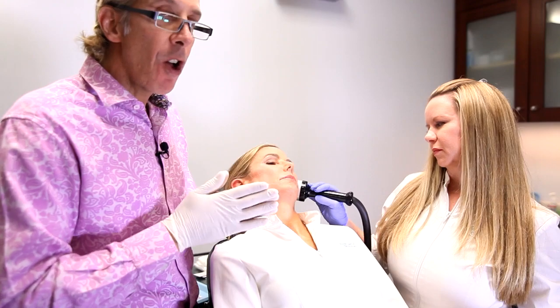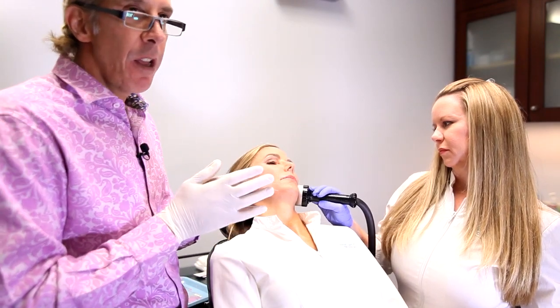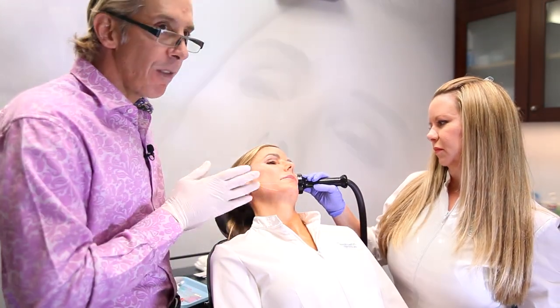The suture is gradually degraded between 4 and 6 months. The whole procedure takes approximately 15 minutes to do a lower face, and it almost feels similar to getting filler in this area. There's no downtime, there's no restrictions on activity. Most people have a little bit of bruising, but not everyone. But we can take care of that with a laser to shorten your duration of bruising to about a day or 2 if you do have bruising.